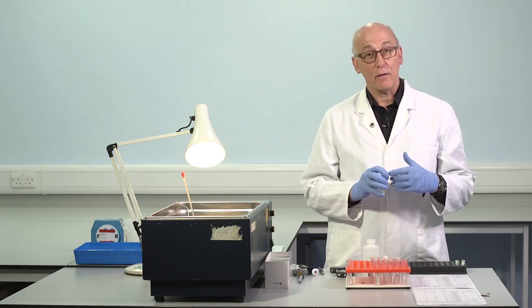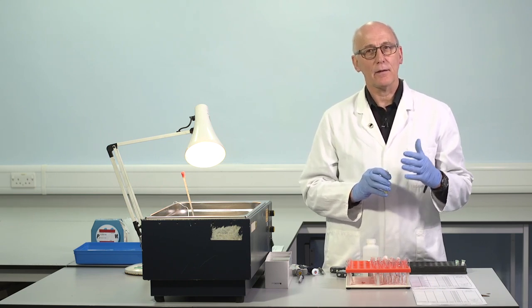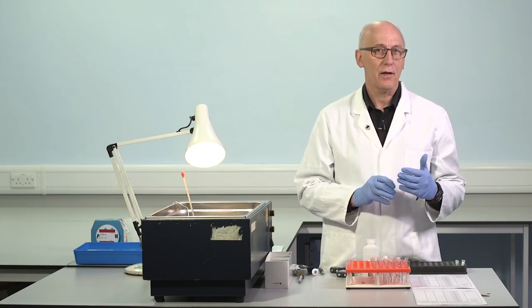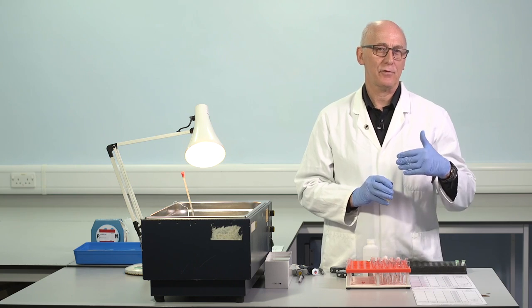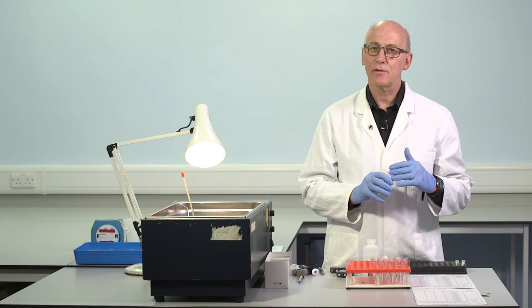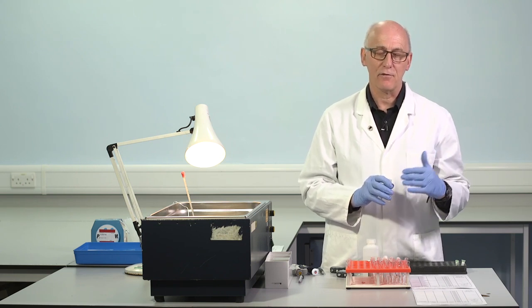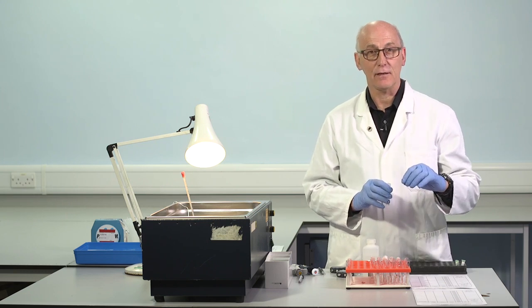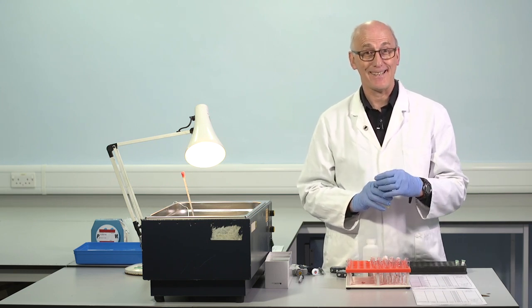If we were making a full factor VIII assay, and this were a calibration plasma containing close to 100, we might, for example, use 1 in 10, 1 in 20, 1 in 40 dilution. This contains approximately half that concentration, as we've mentioned. We need to take that into account in constructing the further dilutions for the factor VIII assay.